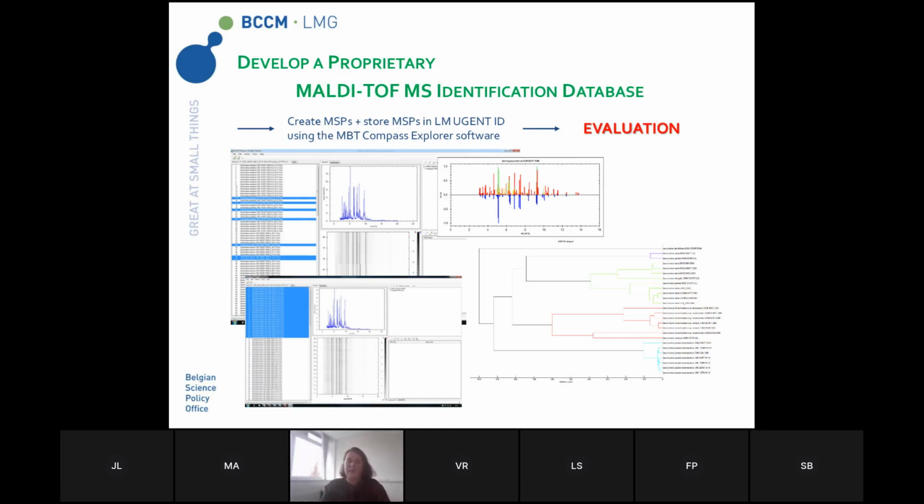What is also important in the evaluation is to look at, for instance, closely related species or species that generate similar mass spectra, and take that into account in your assessment of identification projects, because it could be an identification between 1 or 2 strains or species, my apologies, or more. It's like the matching hints that you get from Bruker identification reports as well.